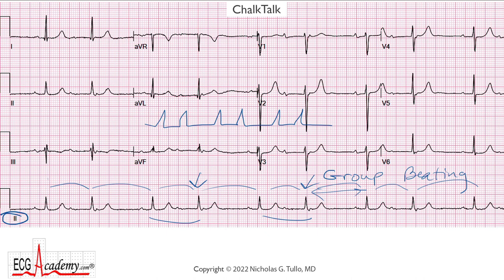There are a number of different things that will cause group beating — in particular here, groups of two. So what you have to think about is atrial bigeminy, where every other P wave is premature. Sometimes the pauses are due to blocked PACs, and then finally, group beating classically can be due to some kind of AV block. So let's figure out which it is.